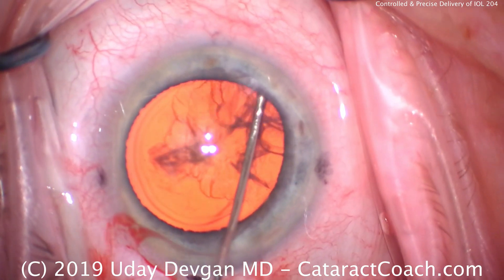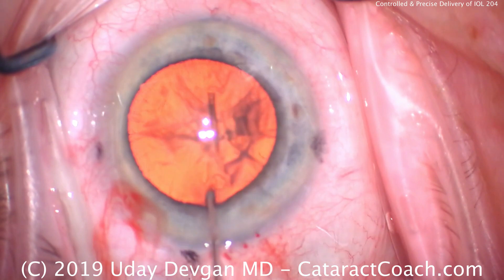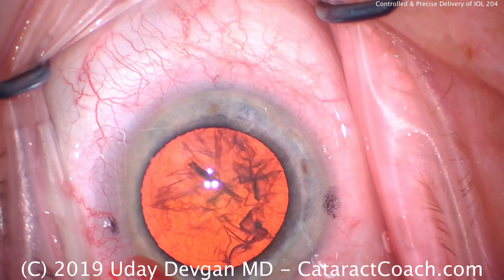Let's look at this case again — doing some hydrodissection here. We saw good capsulorrhexis being performed. This patient has a nice bright red reflex. The lens rotates now — that looks great. And we're going to do our usual phaco chop technique.